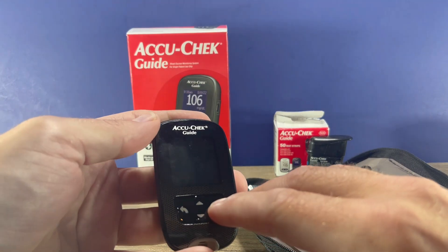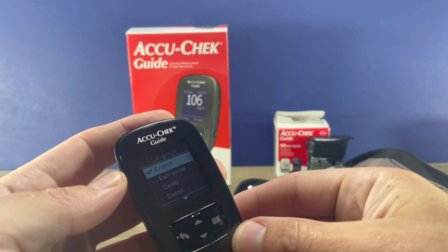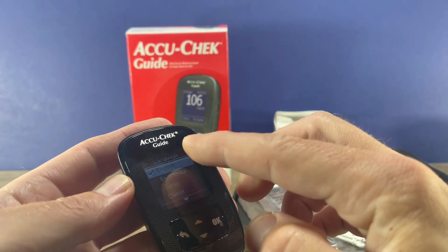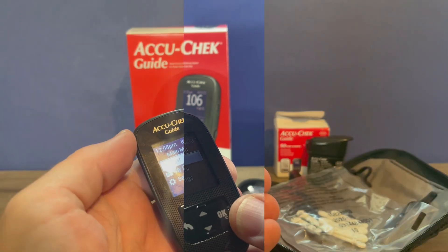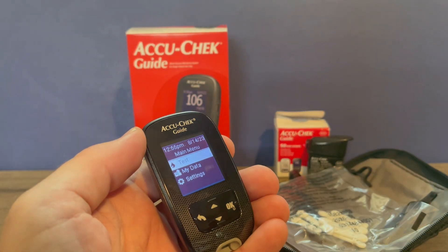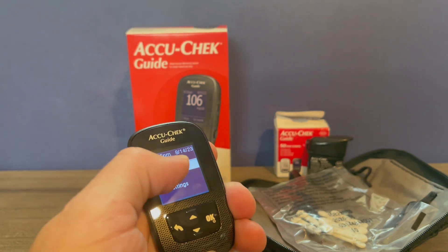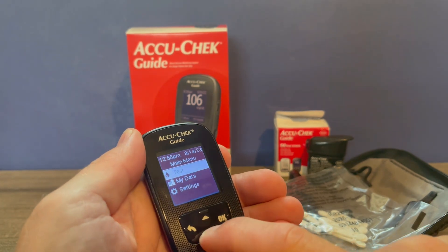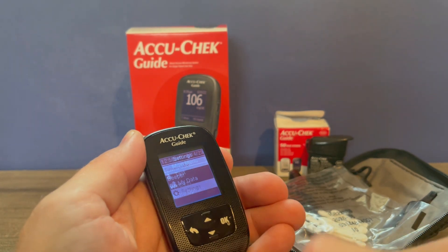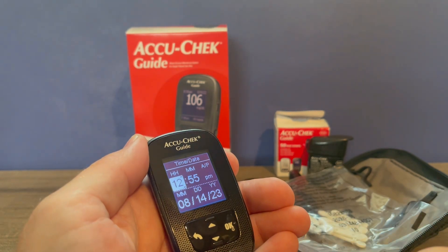You can press the OK button to power on the meter and it's going to ask you to select your language. Pick your preferred language and hit OK. After you choose your language it will be ready to test, but you can also check your date and time. It is displayed at the top, and if you need to change that you just arrow down to settings, hit OK, then pick the time and date and hit OK once again.